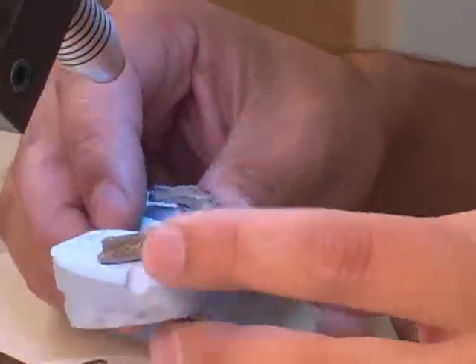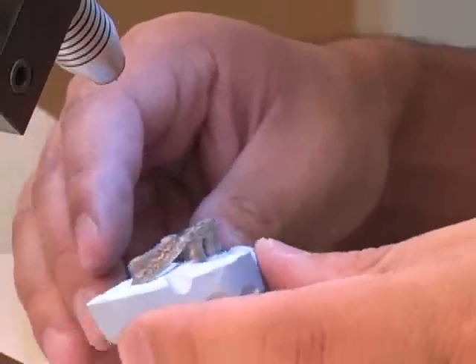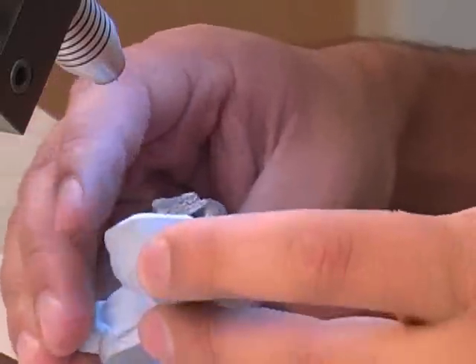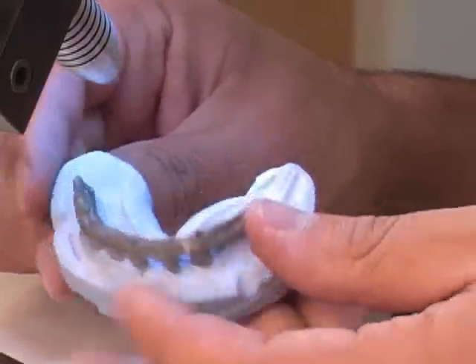We just added a piece here to heighten our implant bar, so you can see the weld going all the way around, and we just cleaned it up.